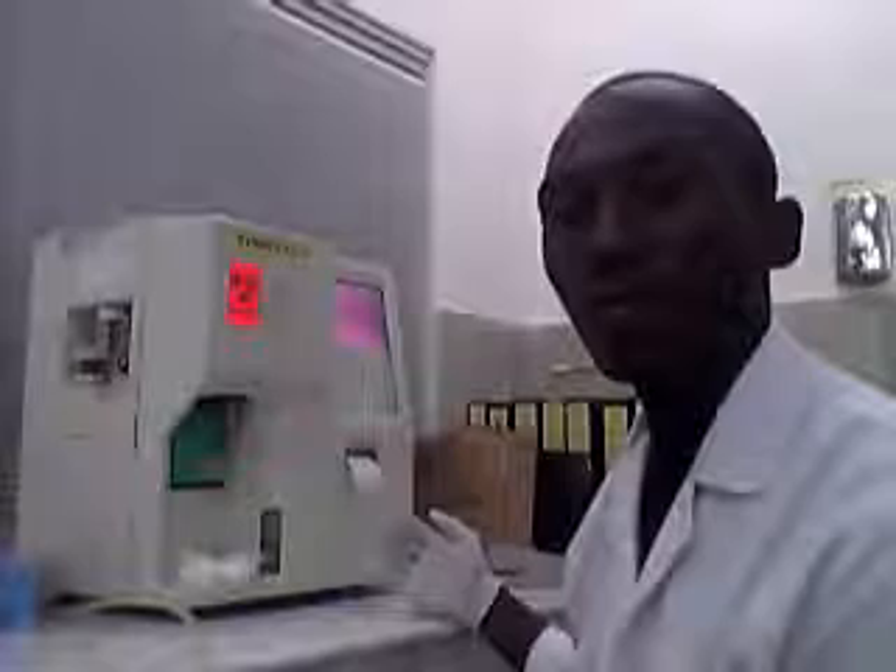This machine is portable. It is easy to use and also provides quality test results within a short time, and it can be carried from one place to another. It is not expensive. Furthermore, you can use it even when the sample volume is insufficient and still get results.